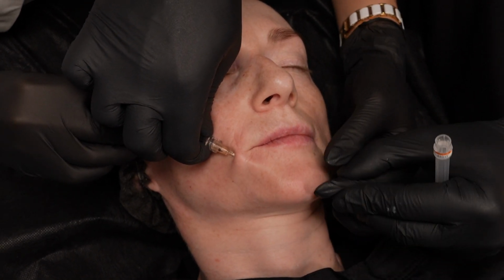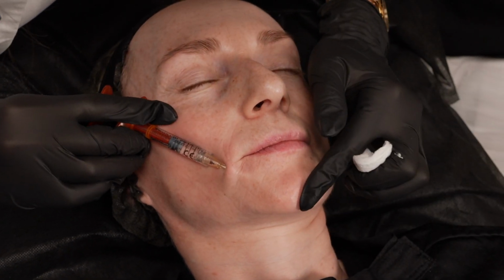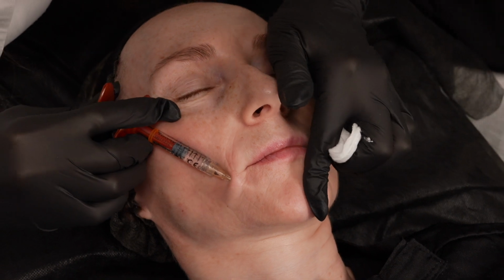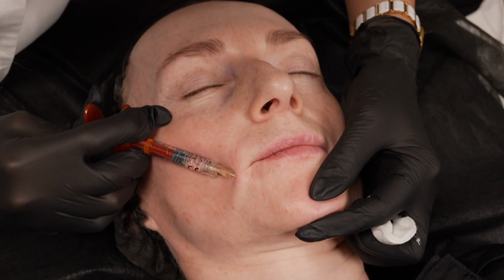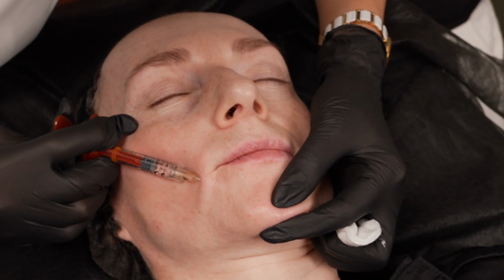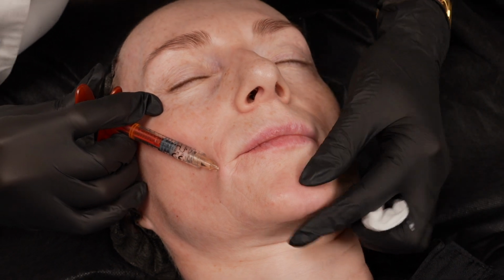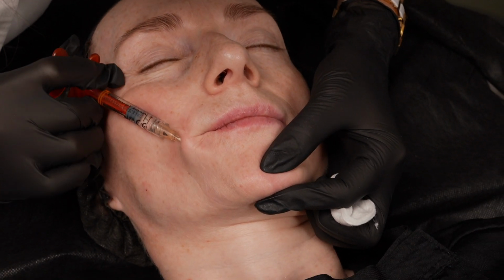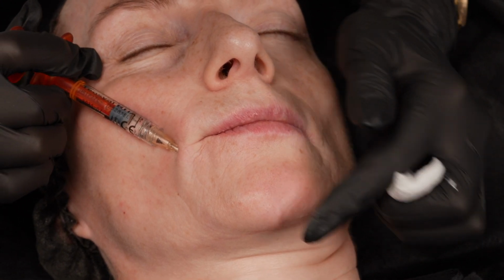Come to the center here. Feel with your finger. Then fill it. Кладем, рука не будет расплываться. Там надо, чтобы она чуть-чуть, если прям в центр поставить, она раскроется, и она даст вот эту круглую форму подбородка. Потому что сейчас он такой, как двойной, даже не уплощенный, он немножко втянутый. Поэтому он дает такое мужское изображение подбородка, хоть и маленькое.